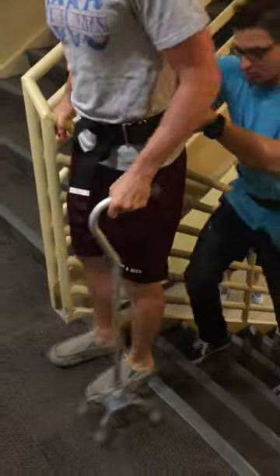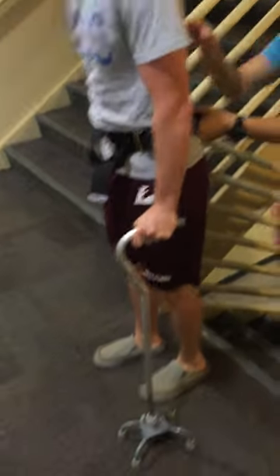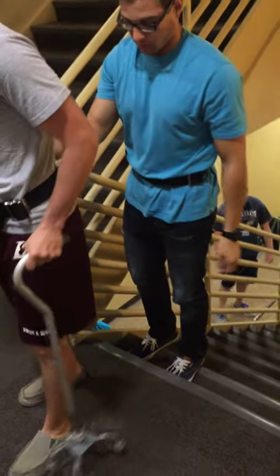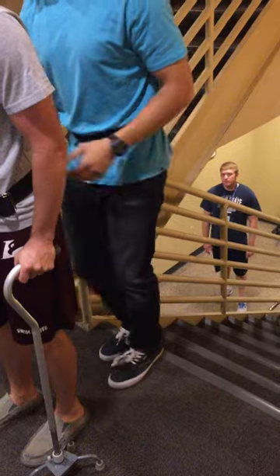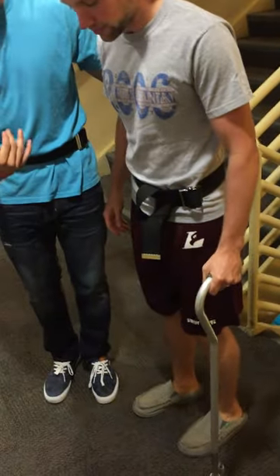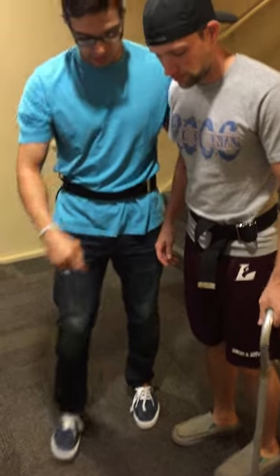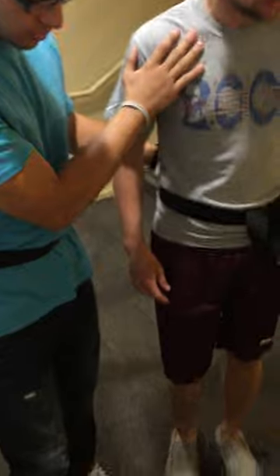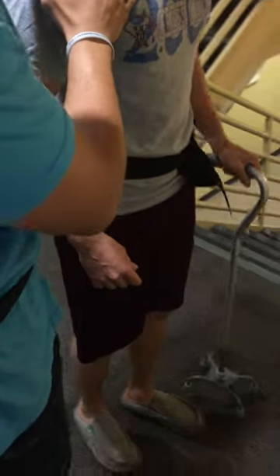Alright, stay right there for me. I'm going to come around to your right hand side, so take a step forward there. Now we're going to turn around here, but we probably want to turn towards your good side. So nice and small steps. We're going to start back this way on the cane.